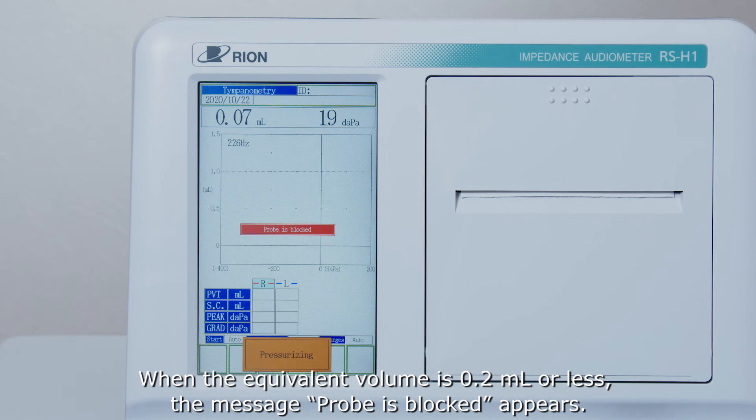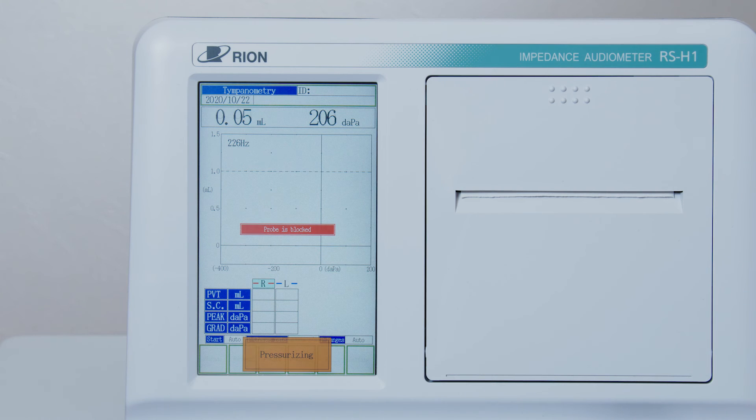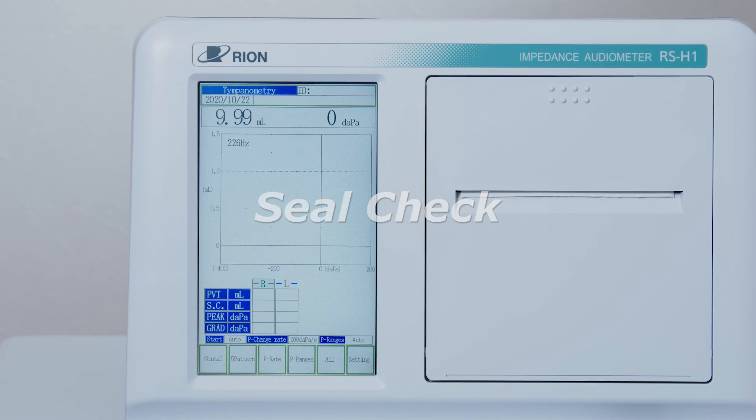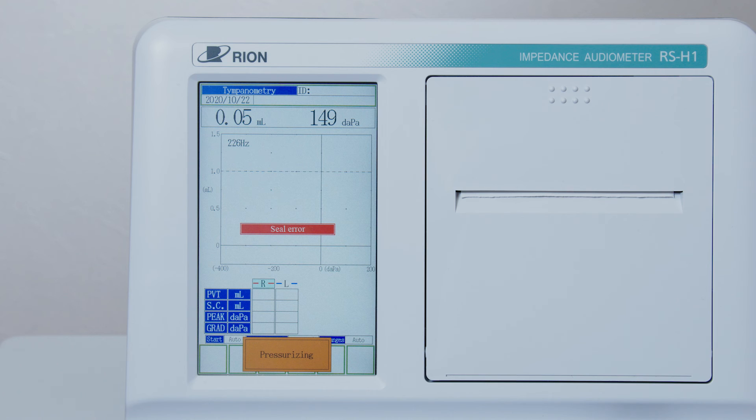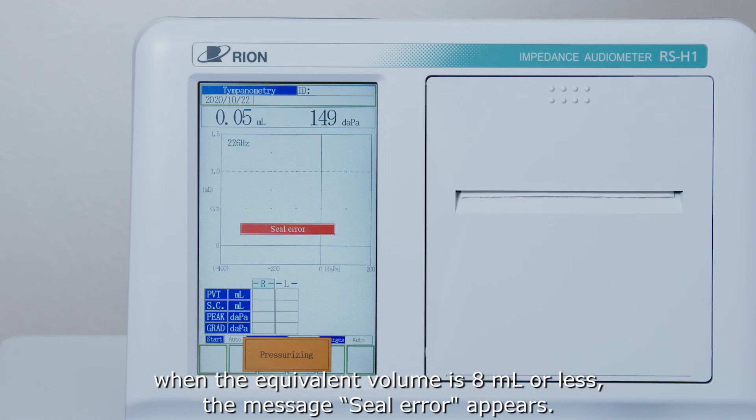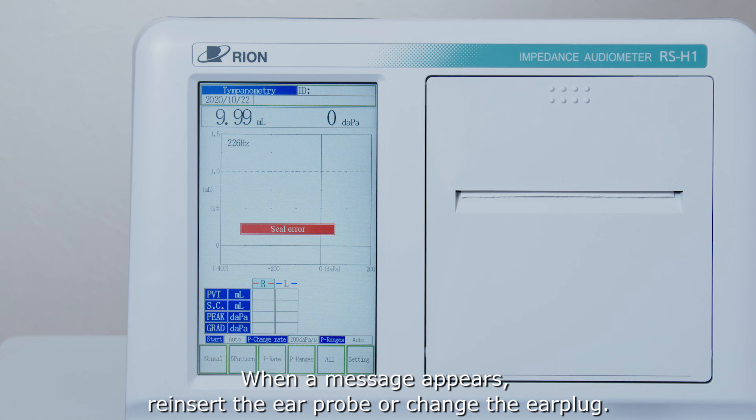When the equivalent volume is 0.2 millilitres or less, the message 'Probe is blocked' appears. When a seal-related message appears, reinsert the ear probe or change the ear plug.